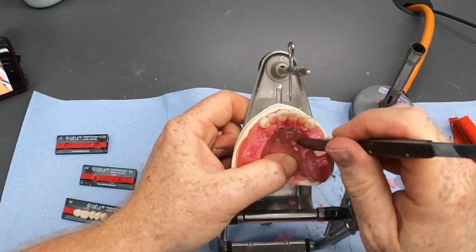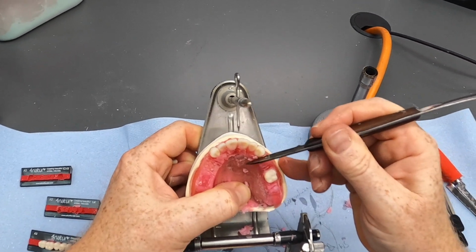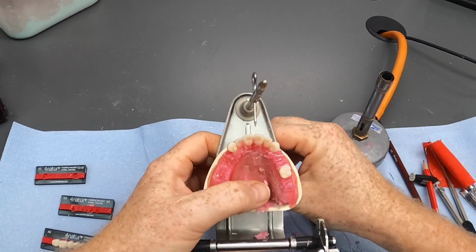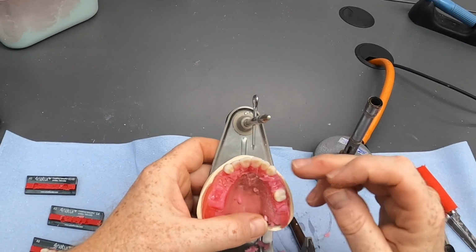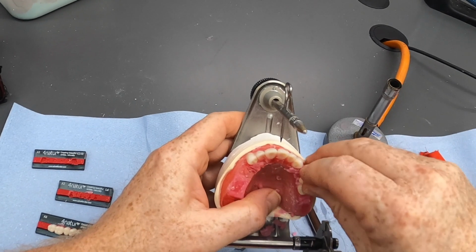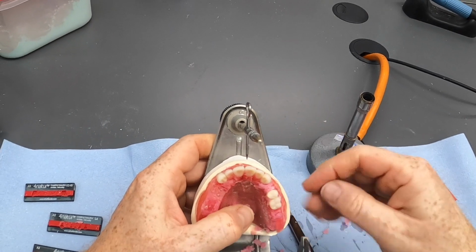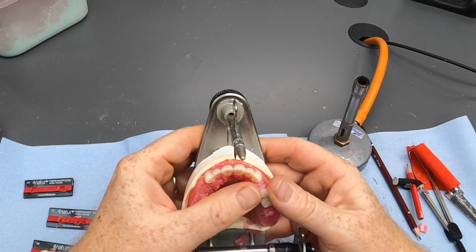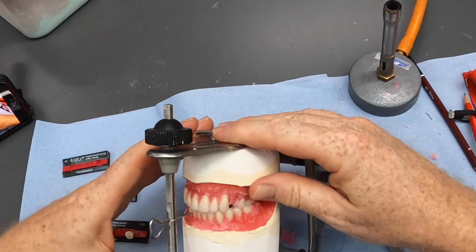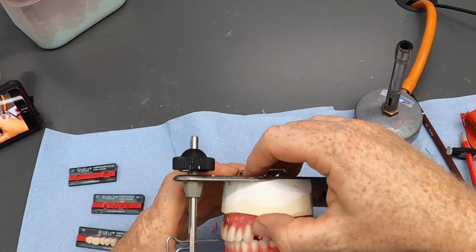If we do have a gap, it's not the end of the world. Usually you can't tell. Some people position the 4, the upper 4, when they're positioning the anterior teeth for aesthetics as well. I haven't in this case, I've kept it simple, but let's have a look how we get on. And that means they have to do all the work on the 5 to incorporate a gap or put a bigger tooth in or whatever.